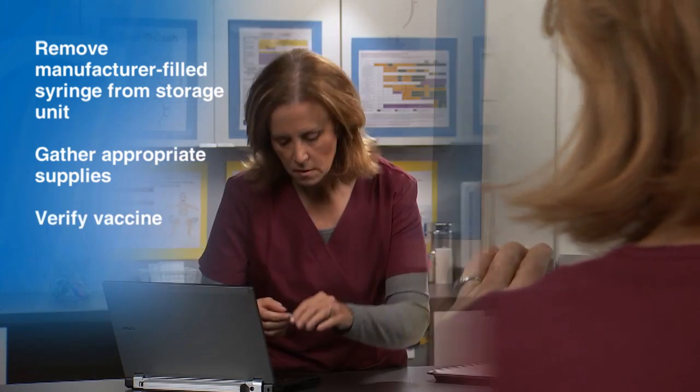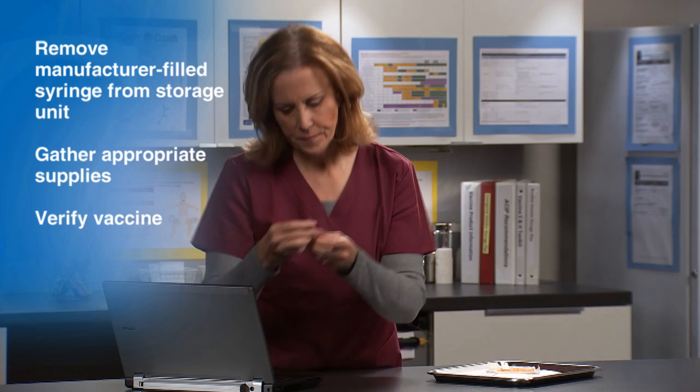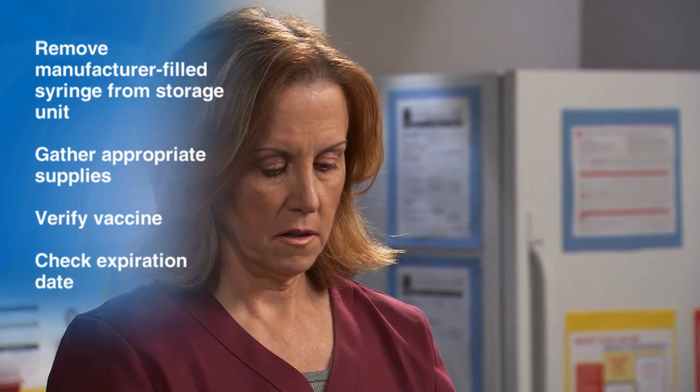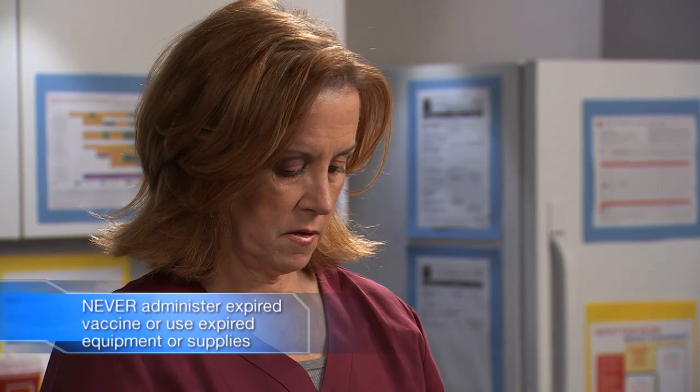Verify the vaccine you are preparing matches the standing order or the provider's order. Then check the expiration date on the vaccine. If applicable, check the expiration date of the needle. Never administer expired vaccine or use expired equipment.